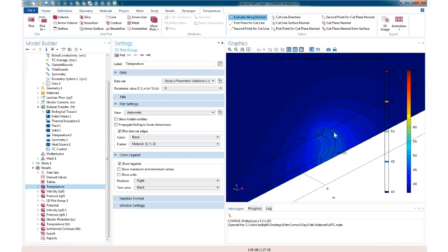So let's see what happens when we turn blood flow on. And here, this is looking pretty nice. Once again, my thermal control is working. You can see my 45 degree isotherm running right through the center of my thermocouple, and there's a nice lesion. Now I'm going to increase the blood flow. And my hypothesis is that I ought to get about the same size lesion because now I'm controlling for the thermal cooling.